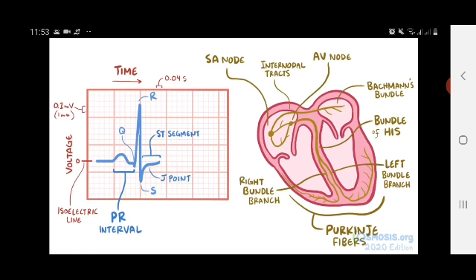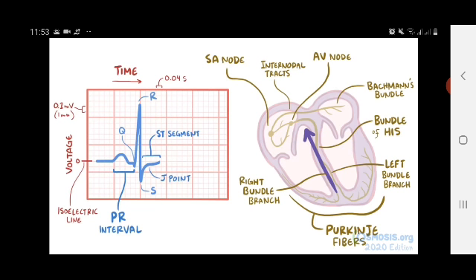After that, the ventricles have to repolarize, or become negative again, to reset themselves in preparation for another wave of depolarization. Now, repolarization moves in an overall direction upward, opposite the direction of lead 2. So you might think that it should be a negative deflection, right? But really it's still a positive deflection, since this time it's a wave of negative charge. So essentially now when it's moving opposite to lead 2, it's a positive deflection on ECG. And this final wave is called the T wave.